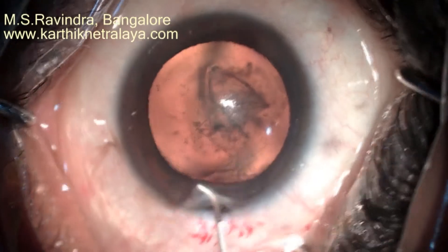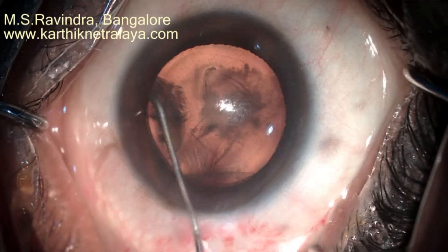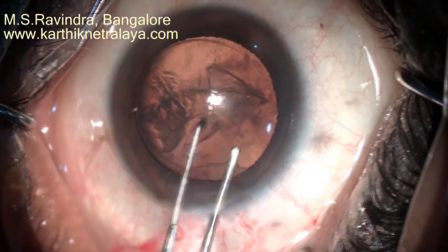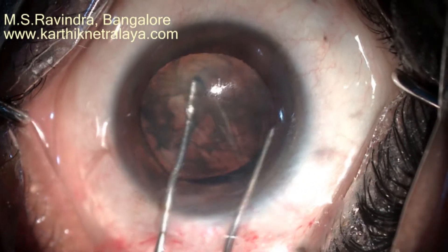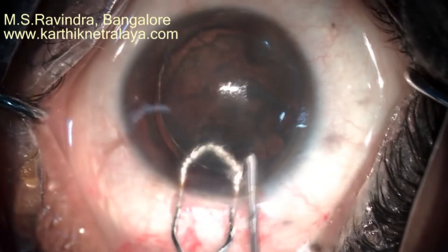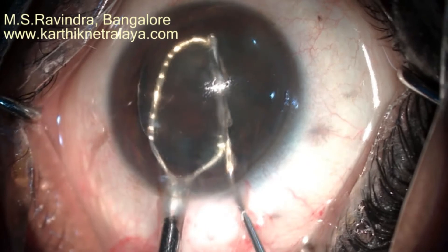A modified 27-gauge cannula is used to create a single-point hydrodissection. The nucleus as well as the epinucleus is rotated into the anterior chamber manually.